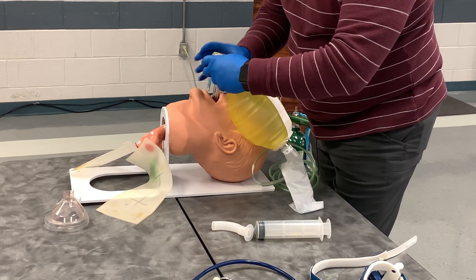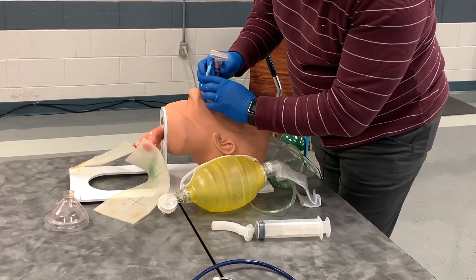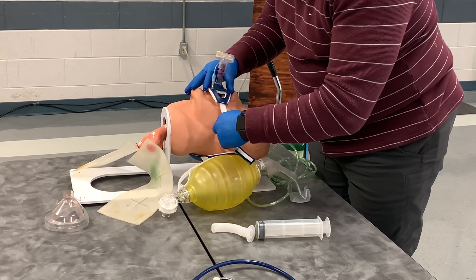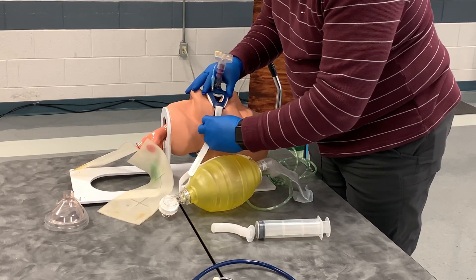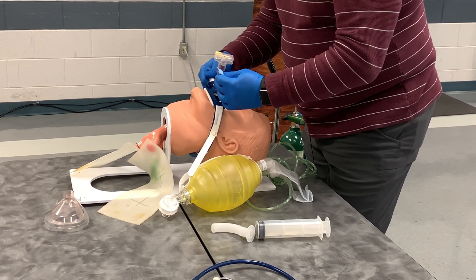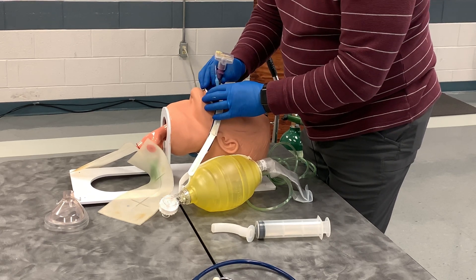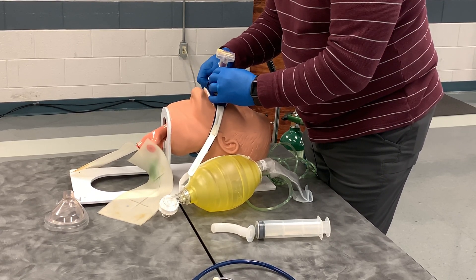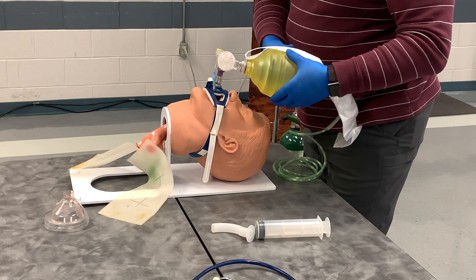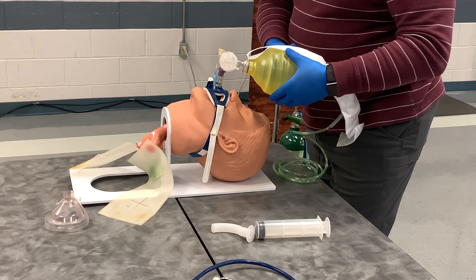For demonstration purposes I am going to remove the bag valve mask. The tube holder will clamp around the tube and the bite block will go in the patient's mouth, then go around and velcro back on itself — ensuring it is not too snug around the neck. I can then tighten the tube holder. Note that with the King Airway you sometimes have to pull back a little before you finally secure it. I will continue to ventilate one breath every five to six seconds, ensuring adequate chest rise, monitoring pulse oximetry, and confirming my CO2 is still showing correct placement.